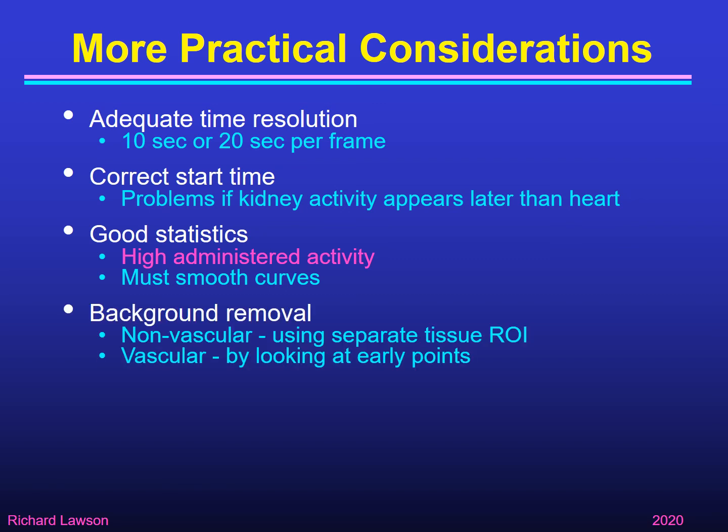We have to remove background. The non-vascular, the tissue background, can easily be removed using a separate tissue region of interest, and the vascular is removed by looking at the early points and finding the plateau and extrapolating it back, as I said.